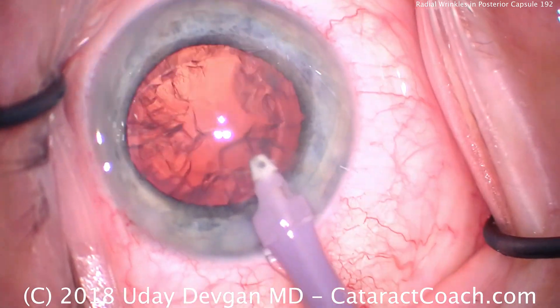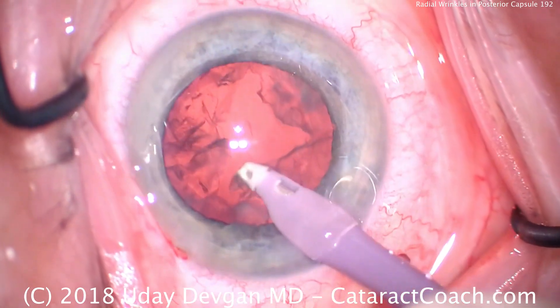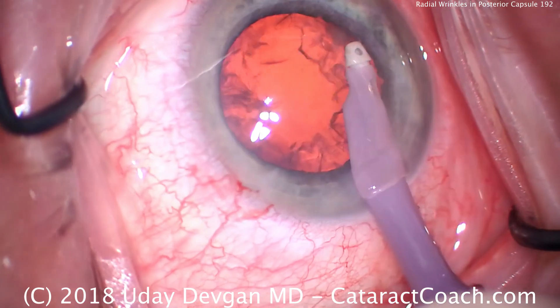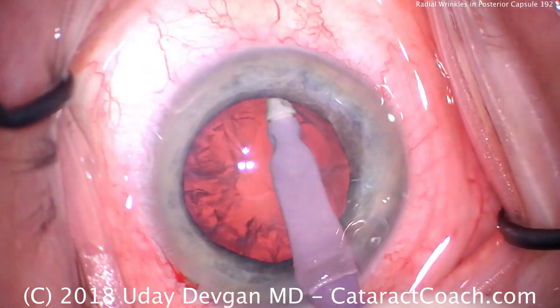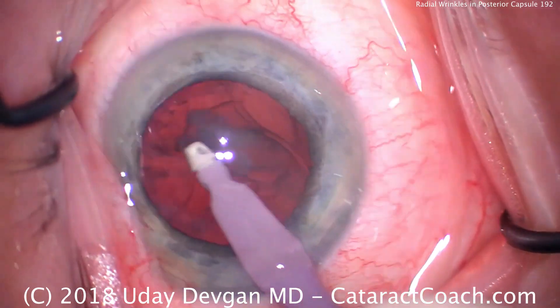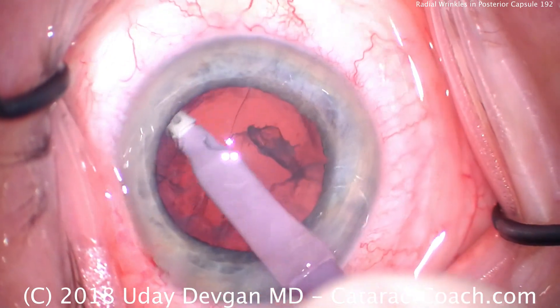CataractCoach.com — we're looking at cortex removal using the irrigation aspiration probe. What I want to show you in this case is what it looks like when you inadvertently grab the posterior capsule with the IA probe. This is where the advanced surgeon tends to break the capsule: during cortex removal, not during nucleus removal.